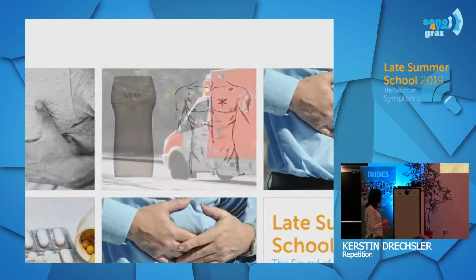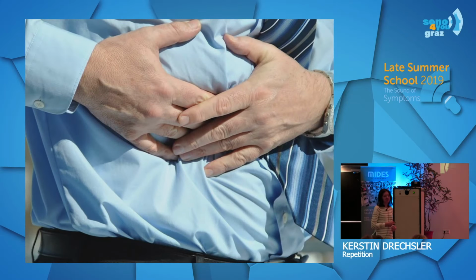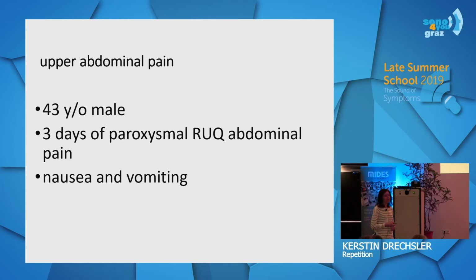We go to the right upper quadrant pain. So imagine a middle-aged man. He has 3 days of paroxysmal right upper quadrant abdominal pain, and it goes along with nausea and vomiting. You do a clinical examination of the patient, but you don't notice anything. But if you think on the history, it sounds kind of biliary origin, so you decide to actually scan the gallbladder and look if there are any gallstones or if there is a cholecystitis. And that's what you see.